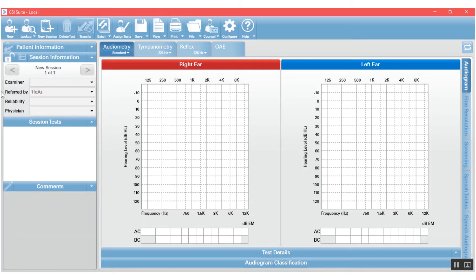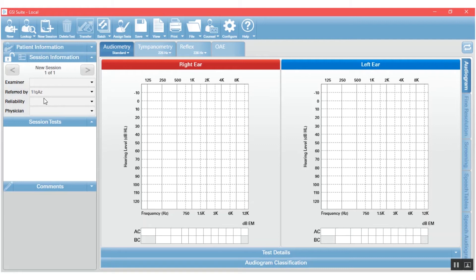The second section is the session information. And this is information that is gathered from the equipment as you transfer the data in. So this is where you would decide or assign the examiner who they might be referred by, reliability, the physician. So this really is the session specific data.